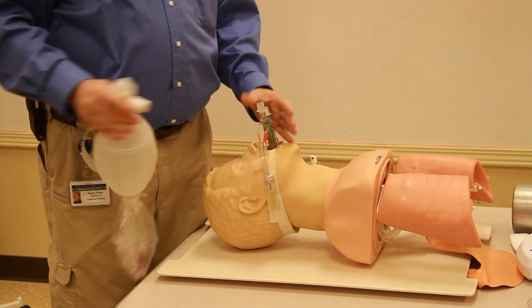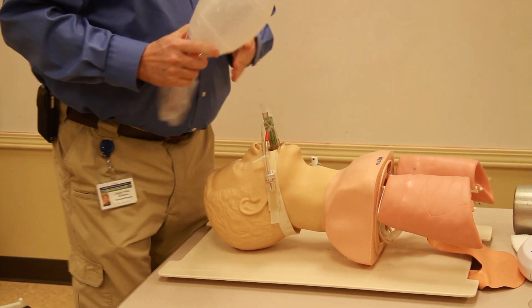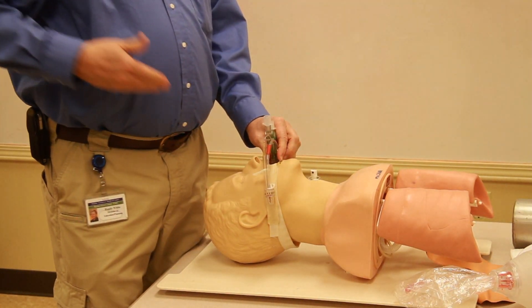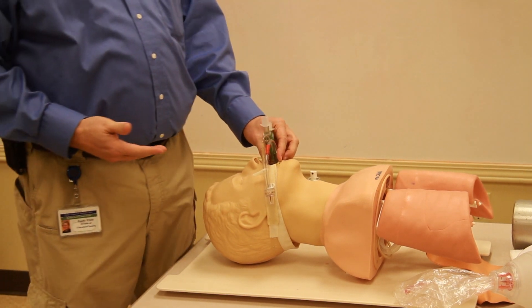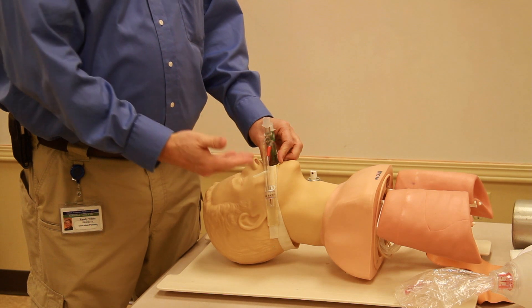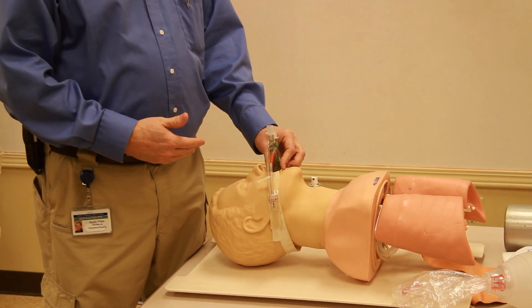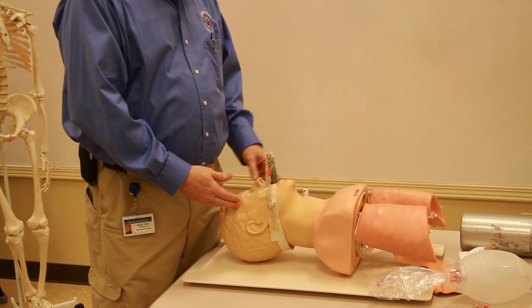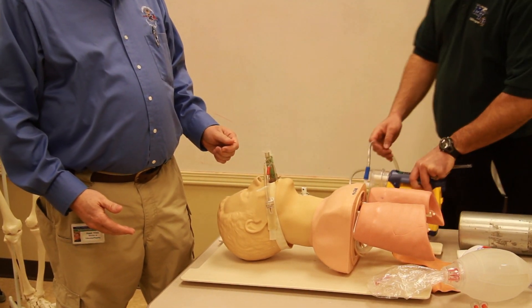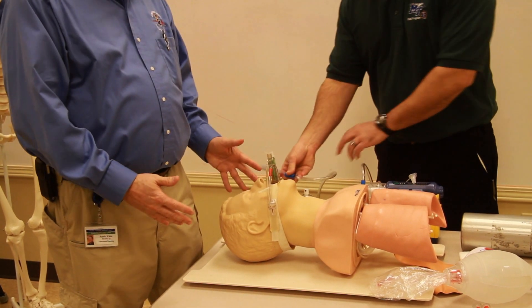Now let's say the patient is coming awake. We need to remove this airway because an awake patient will gag, and 99% of the time they'll probably vomit as you take this airway out. So we get our suction unit ready.